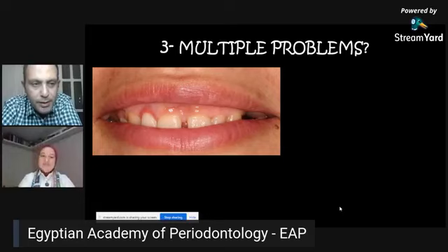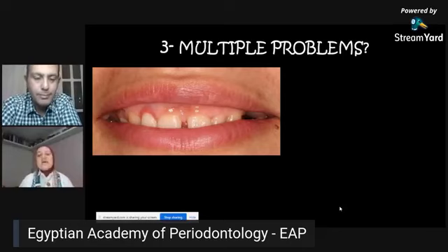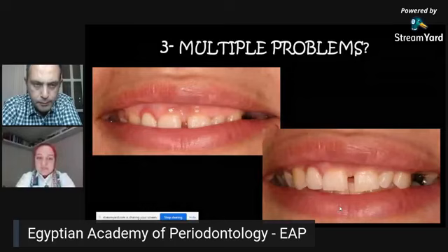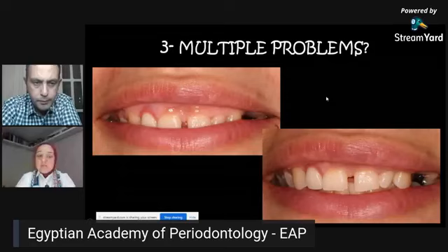Thank you. You're welcome. So the third case is a case I personally like because it had a lot of interventions for me as an implantologist and also as a periodontist. When you have multiple problems, you can see that she has the missing upper left premolars, the 4 and the 5, and of course a gummy smile and very short clinical crowns. And of course, we have an inflammation related to this crown here. You can see it's a localized problem. So you think it's probably related to this defective crown, maybe violation of biological width, or maybe an open margin of the finish line or something.